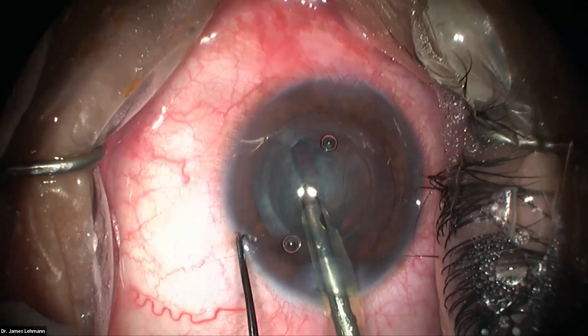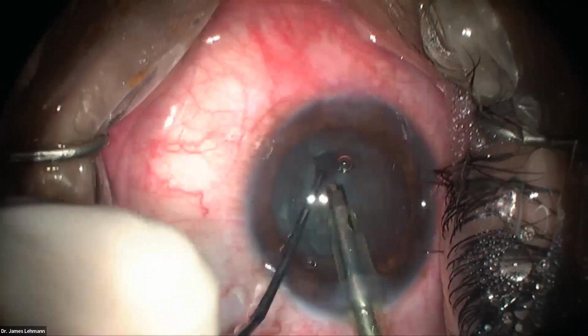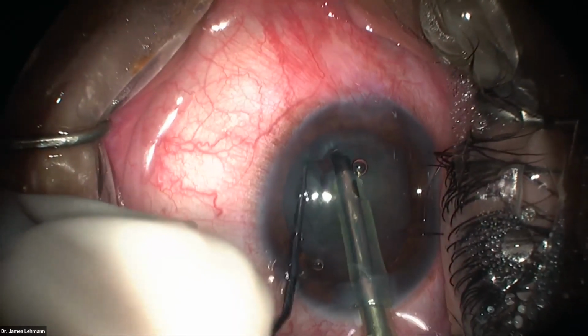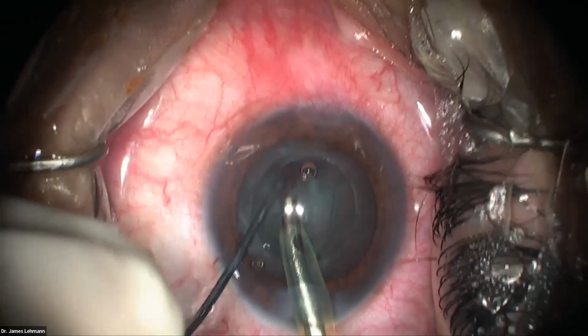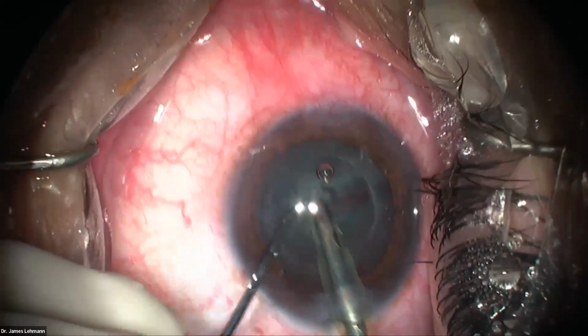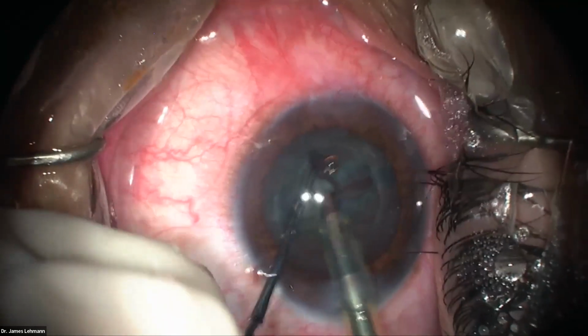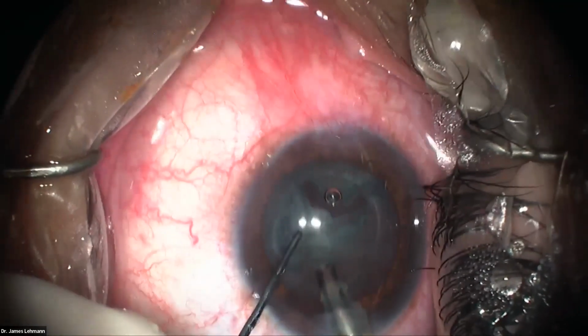I'm going to put my second instrument in. You can see I can freely rotate it. The reason I was having a hard time doing it with the cannula is because I was digging into the cortex. So I did the little fragmentation there. That's good. Remove this extra stuff. And see, look how easily that breaks apart there.